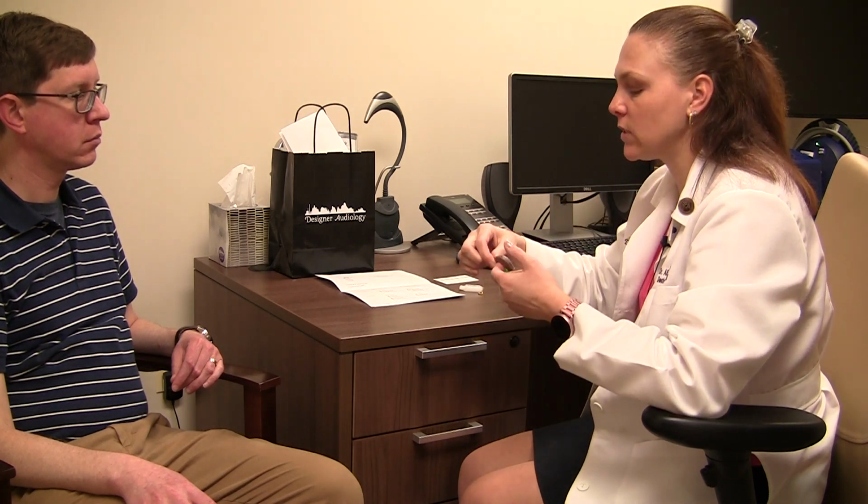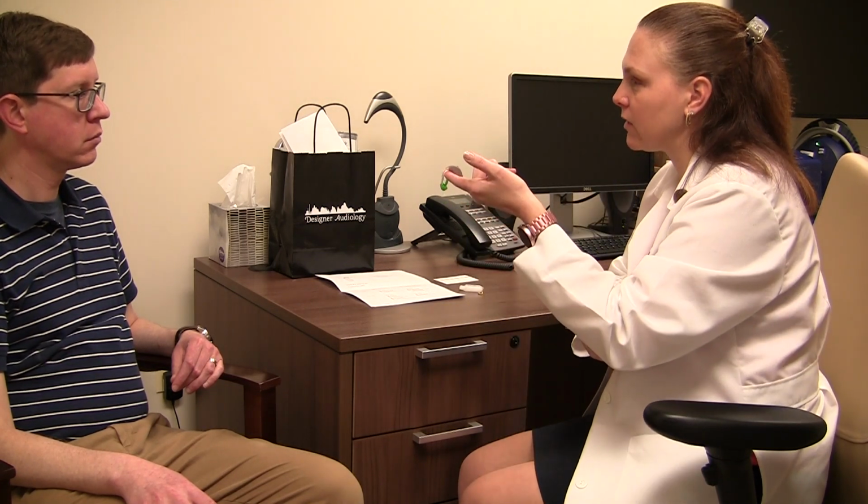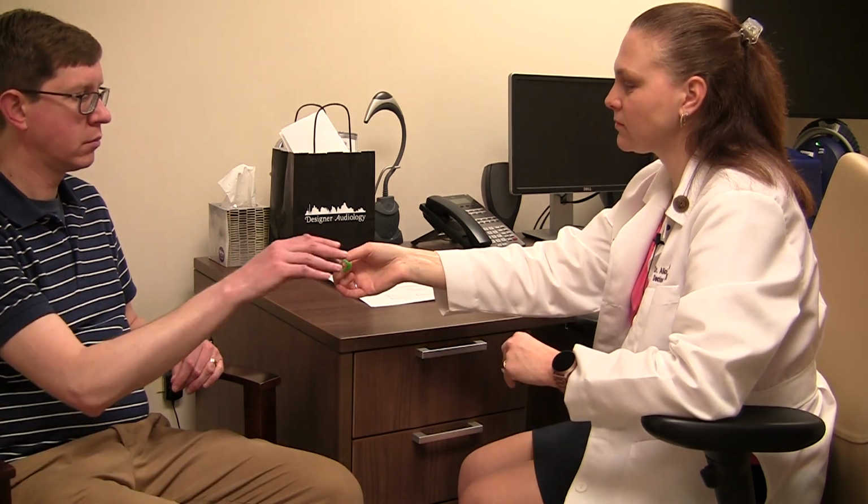There's no right or wrong way to put it on. Most people will take the part and put it over their ear first, and if it's on, it will kind of dangle successfully from your ear, and then they're going to take this piece and push it straight into their ear canal. I'm going to let you find your way to do it, but we're going to practice a couple times on the right side, and then we'll switch and do a couple times on the left side. Feel good so far? All right.